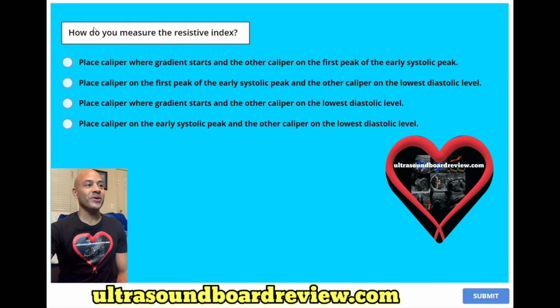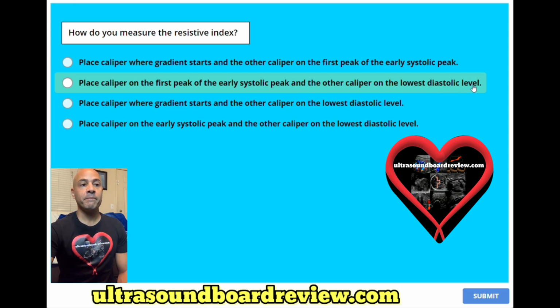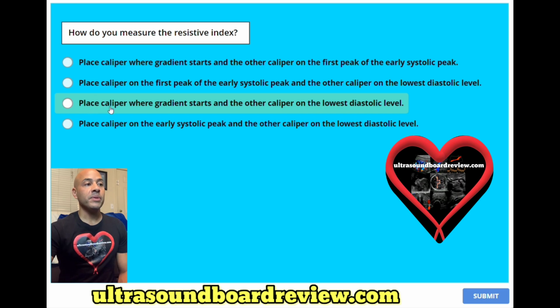Question 102. How do you measure the resistive index? A, place caliper where gradient starts and the other caliper on the first peak of the early systolic peak. B, place caliper on the first peak of the early systolic peak and the other caliper on the lowest diastolic level. C, place caliper where gradient starts and the other caliper on the lowest diastolic level.